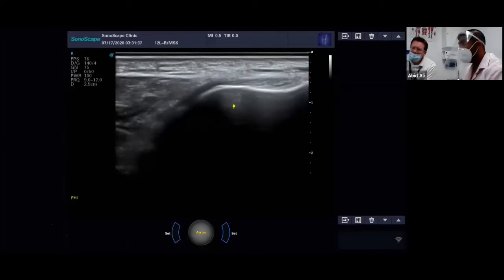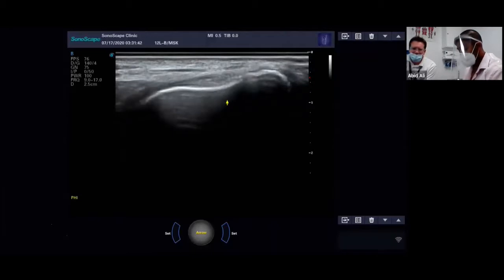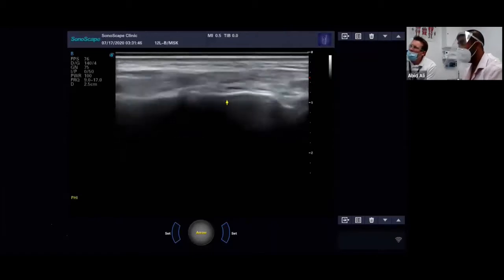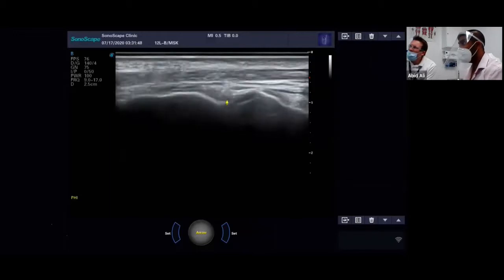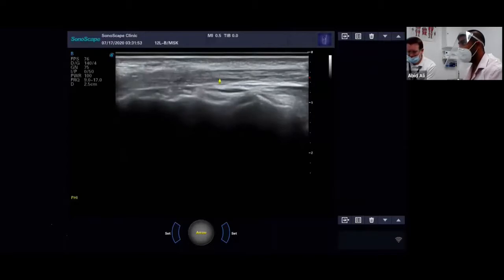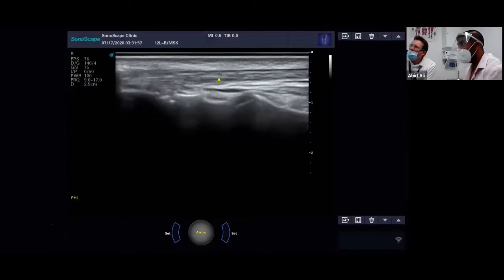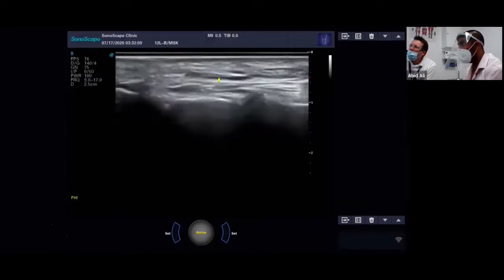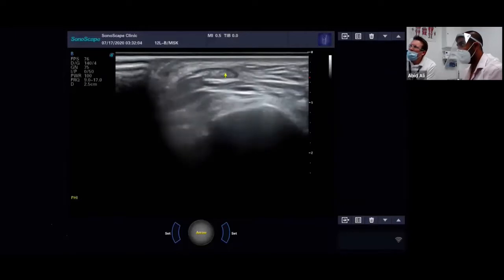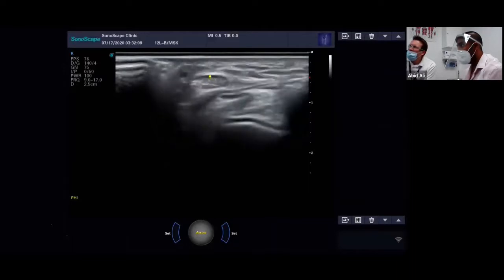Okay, so what we probably should do here now is interrogate this tendon in the cross section as well. So let's find a nice position where we were before. Now you can see the whole tendon in view again. And now we're just going to spin on this, keeping that in the center of the screen. You're going to watch this contracting, contracting, contracting, and then shrinking into this nice, more of an oval shape. And this is looking now at the tendon in cross section.